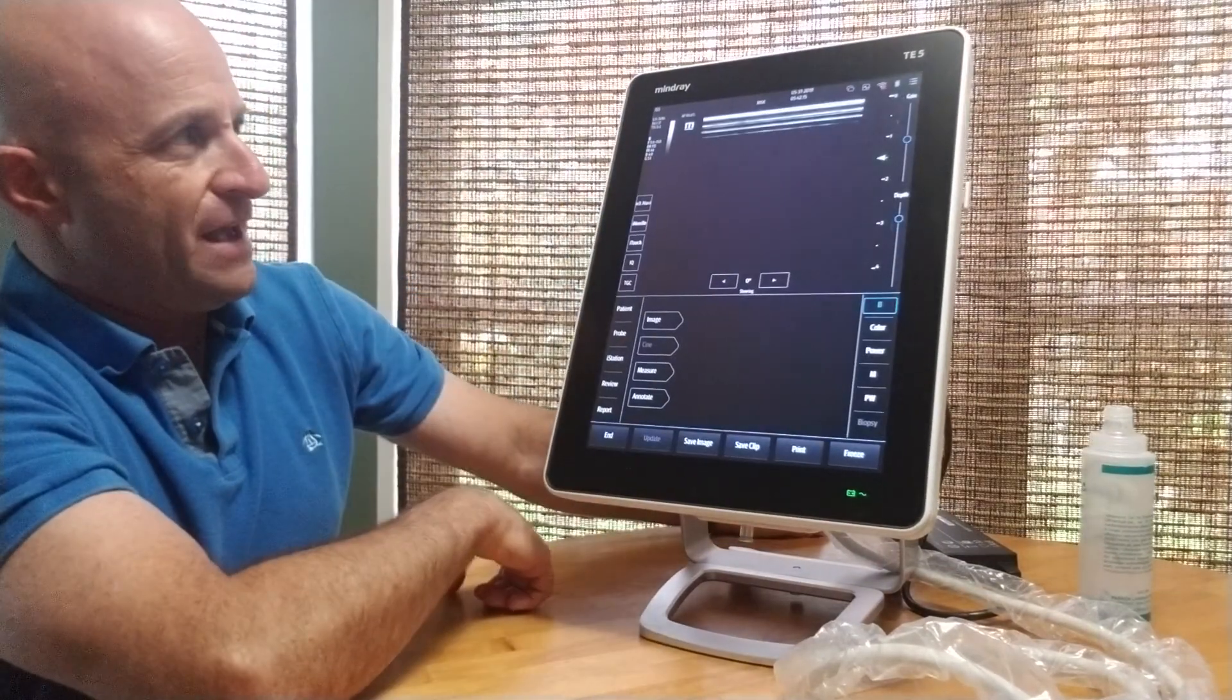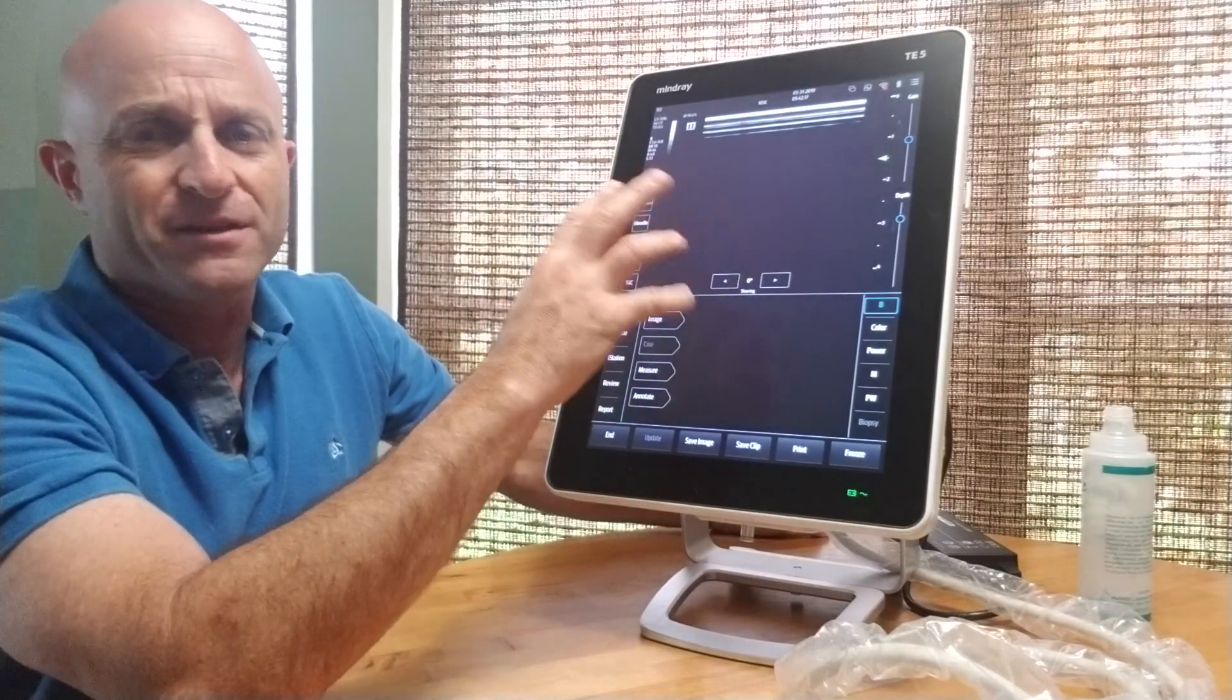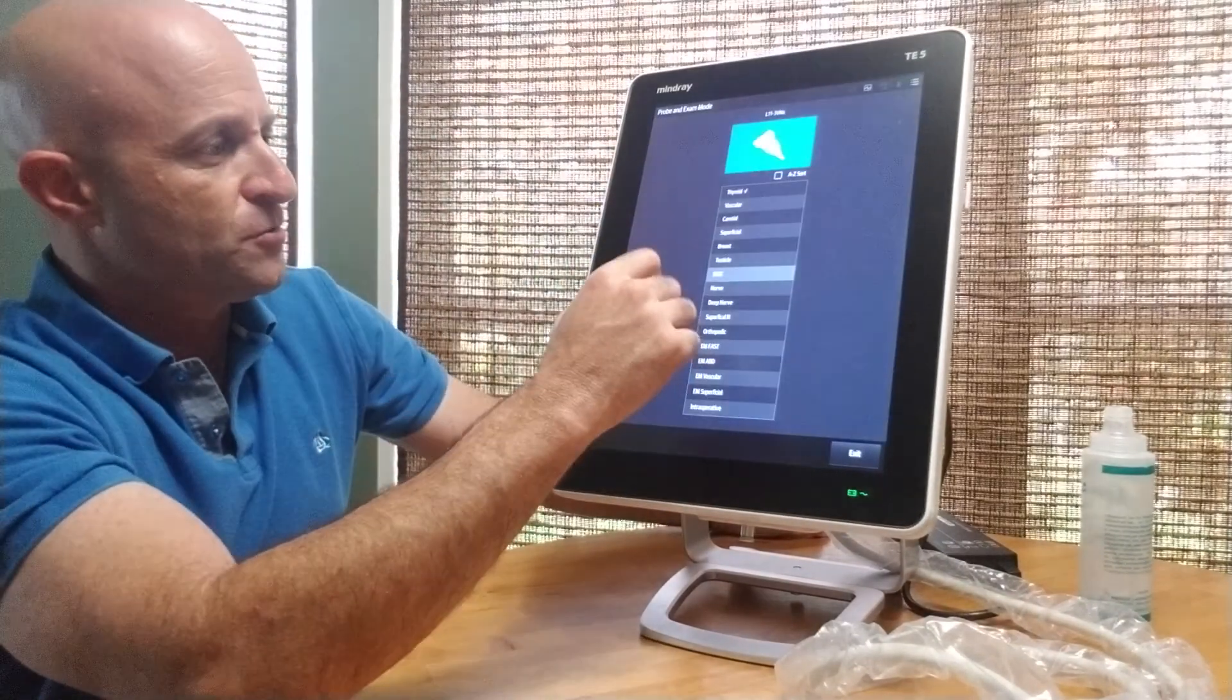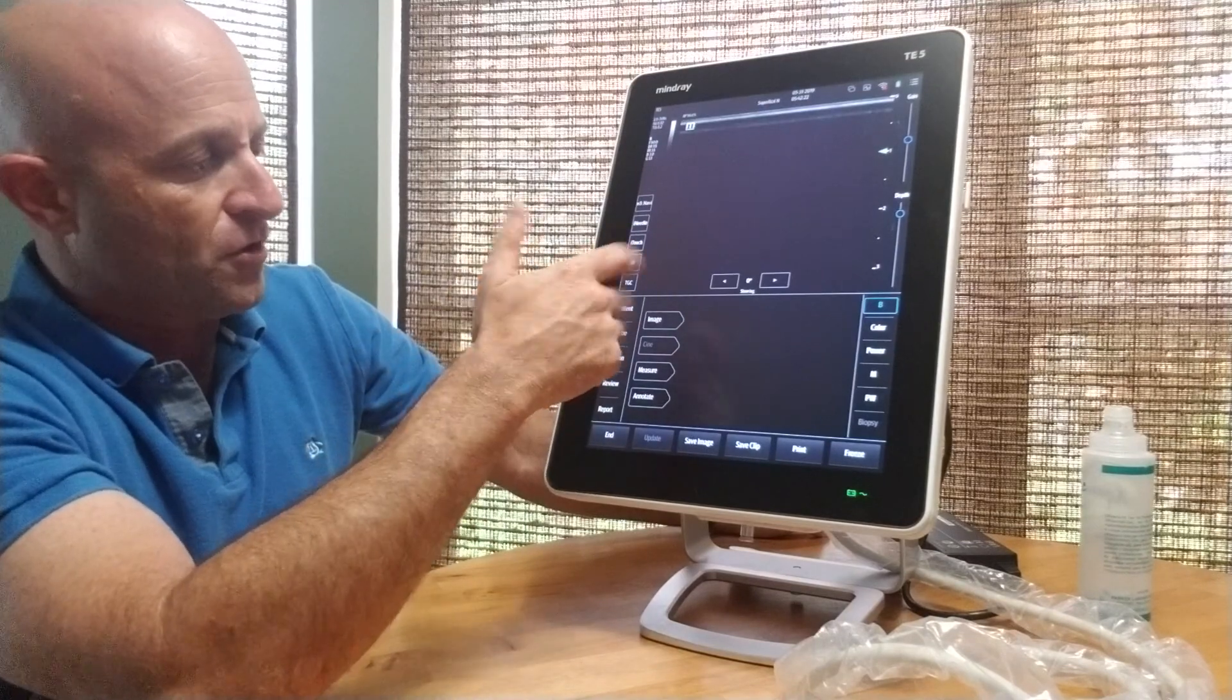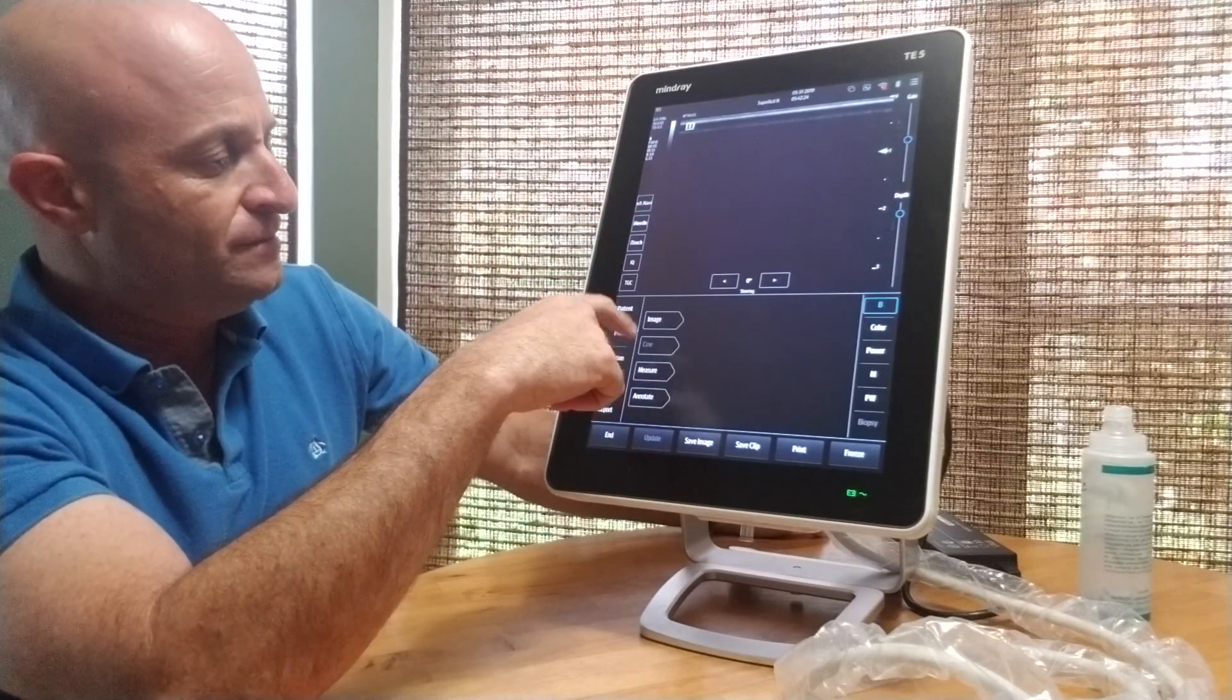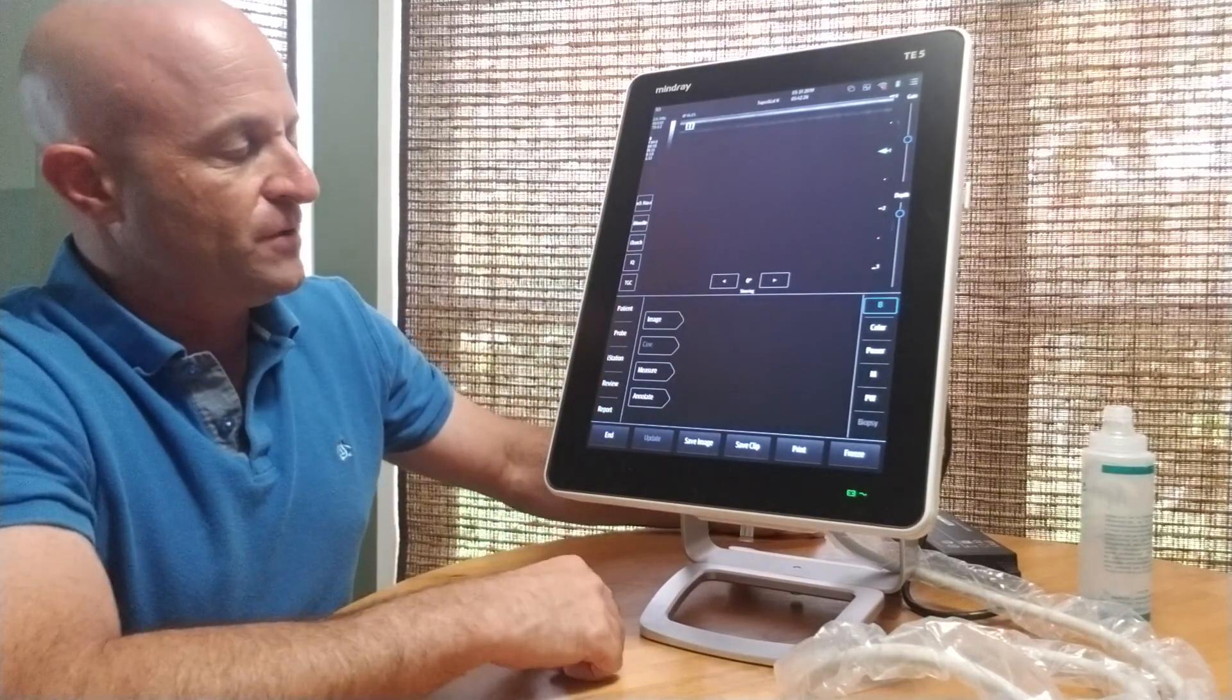If we want to go to MSK, it's now set up for MSK use. If we want to go to superficial, nerve, or whatever it might be, we can select that, and then you're ready to scan.